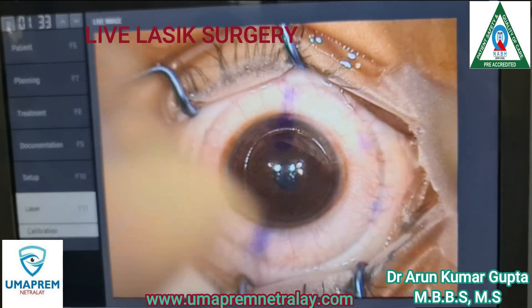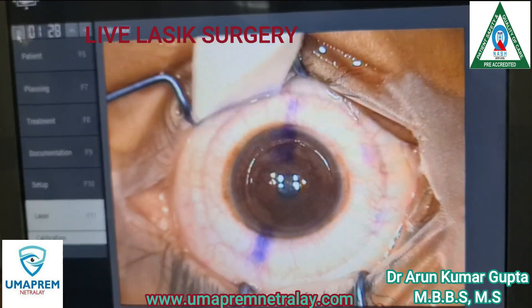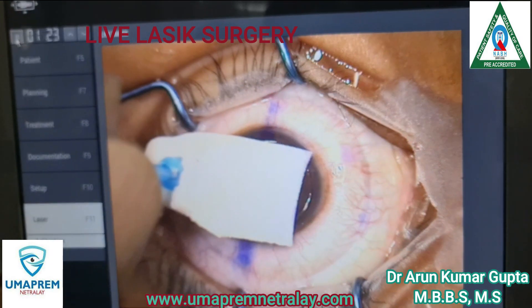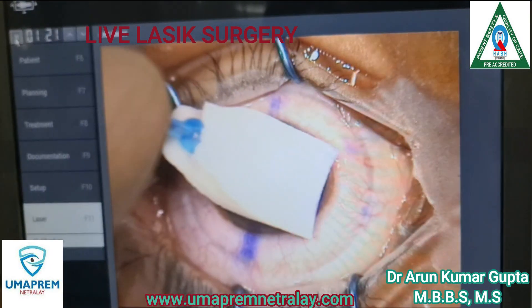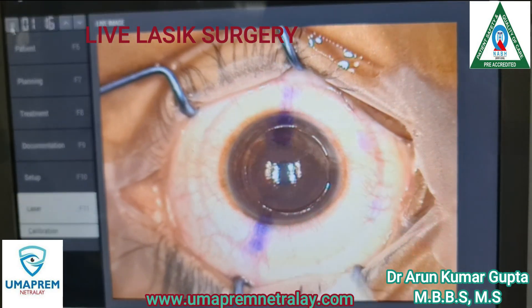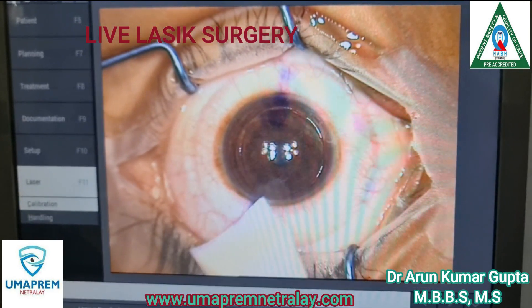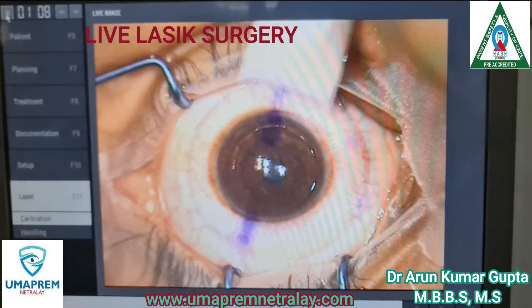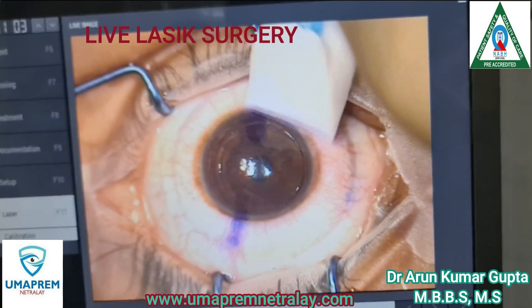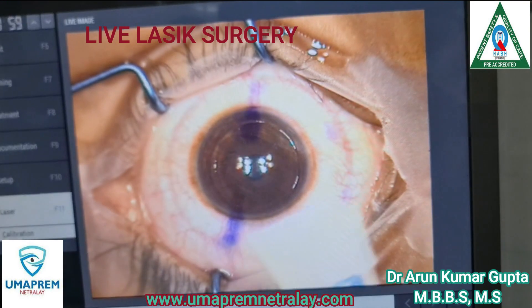Here you can see the perfect cutting of the cornea. For this case, we use the Alcon Allegretto EX500 machine, which is very nice. The classic procedure is very good, and the patient can see 6/6 immediately post-op.